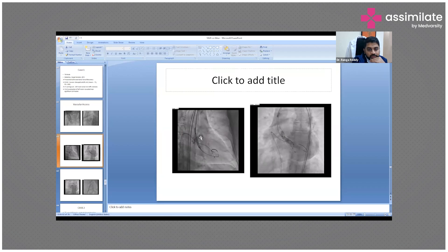This is the aortic valve — here we cross it with the wire. This is a temporary pacemaker placed in the RV, and these two dots you can see are on the wire. This is a balloon. The aortic valve has a lot of calcification.